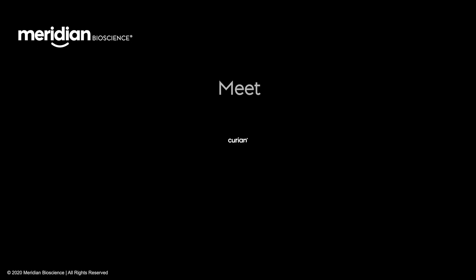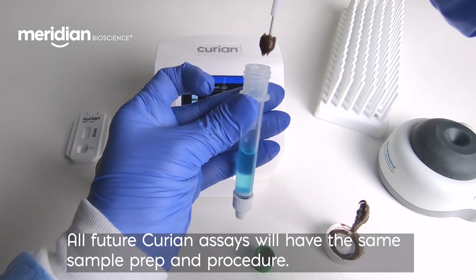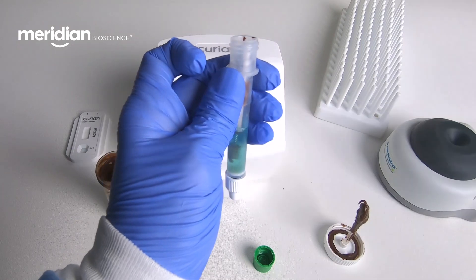Meridian Bioscience presents Curian. First, let's start with the simple sample preparation. AO-PREP means all-in-one prep, an innovative device that allows for comfortable, clean handling of samples.